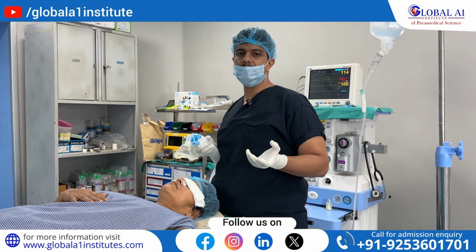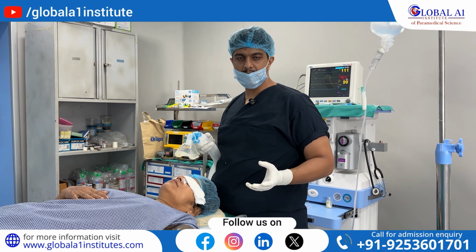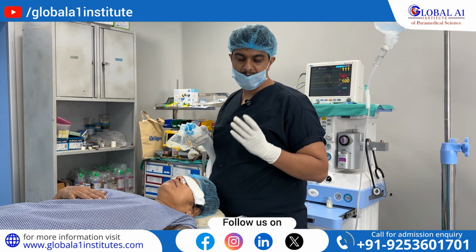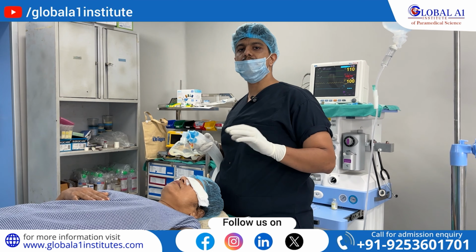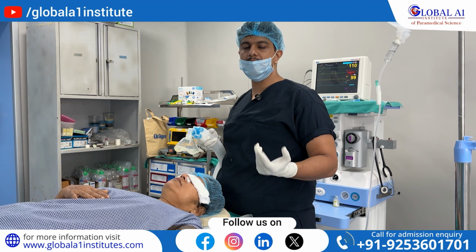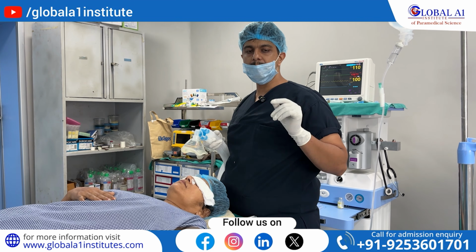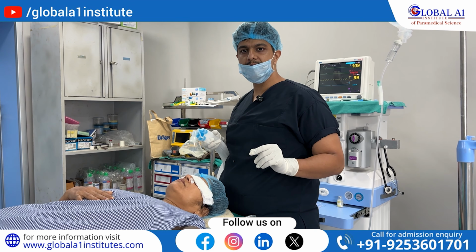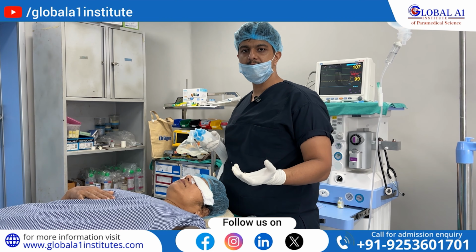In emergency, we have to intubate. In emergency, there is a different setup protocol, and the patient coming into the emergency is never fasting, so we have to follow different steps for intubation. It includes rapid sequence intubation. It is a major thing. We have to learn about it step by step. We will learn in the further videos, right?